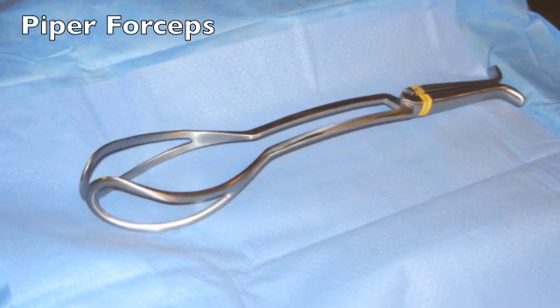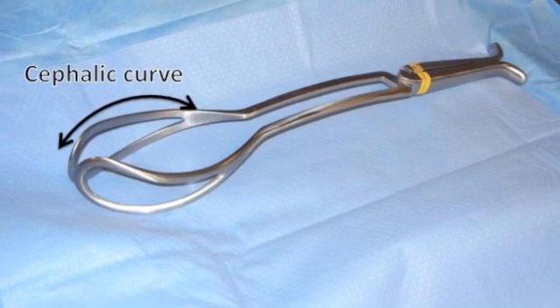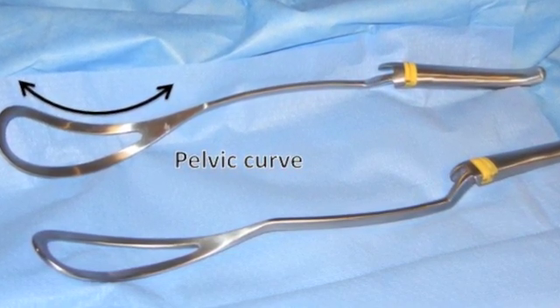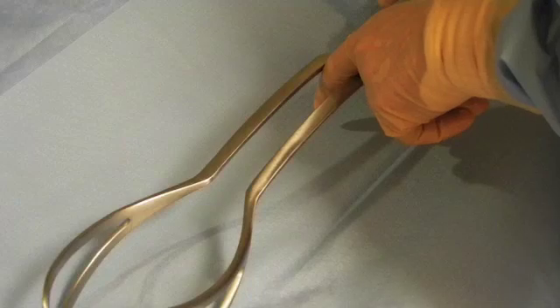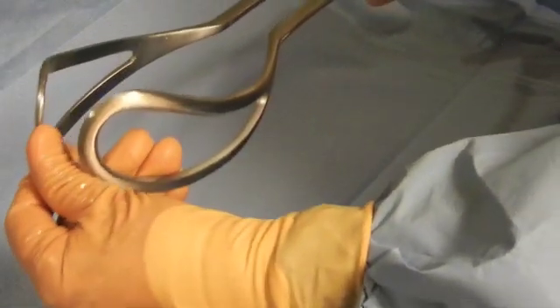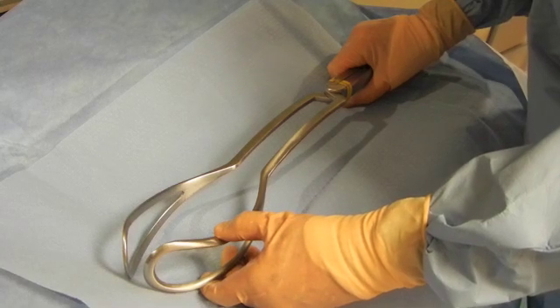Edmund B. Piper designed the Piper's forceps for facilitating the delivery of the aftercoming head in a breech delivery in 1924. There is a cephalic curve to accommodate the baby's head and a pelvic curve to allow the instrument to follow the curve of the maternal pelvis. They have a space between the shanks, they are long forceps, they are springy and have some bounce to them. They're designed for one purpose: the aftercoming head in a breech delivery.